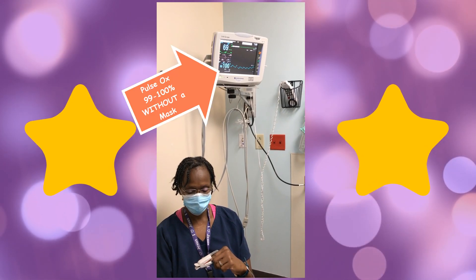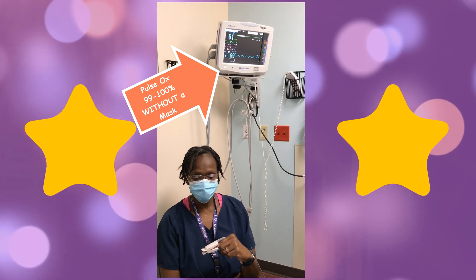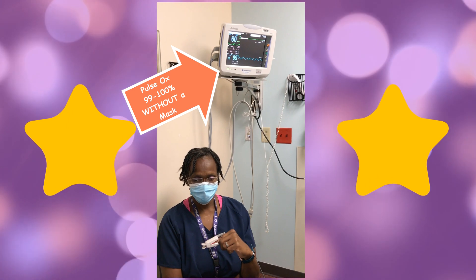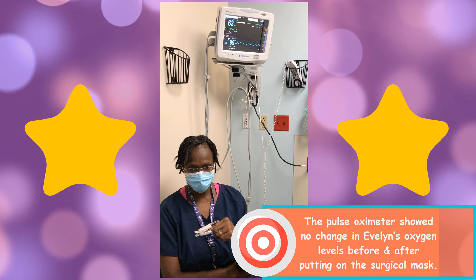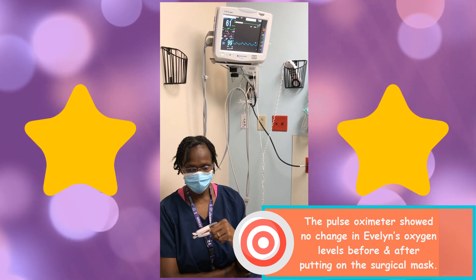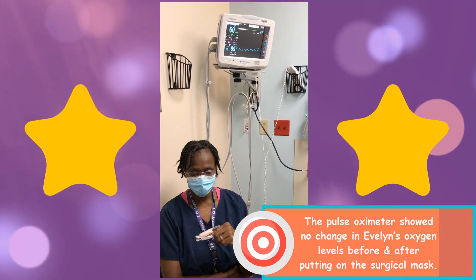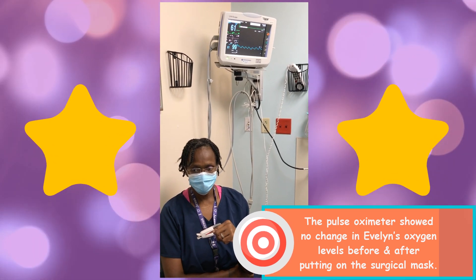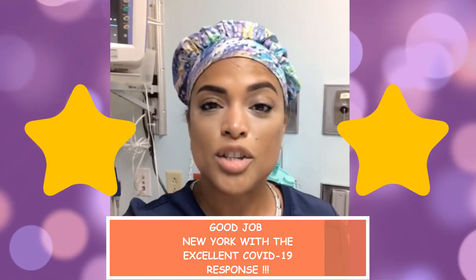Her pulse ox is 100%. I'll leave it on for a couple of seconds — you can see it goes from 99 to 100, just like it did without the mask. That shows you that your pulse ox reading will not change whether you have a mask or not. The mask will not have an effect on the oxygen saturation in your body. Her reading is 99 to 100% both without the mask and with the mask.